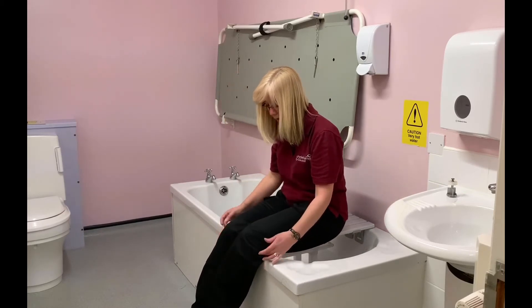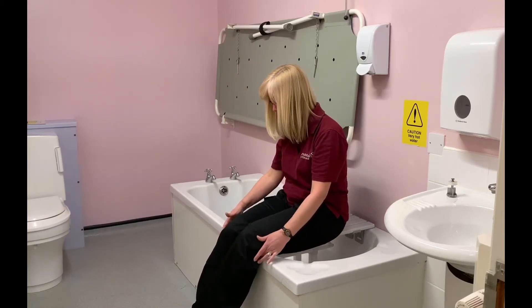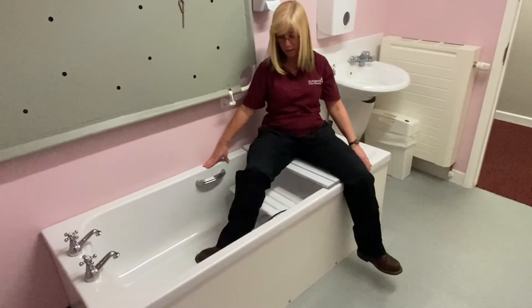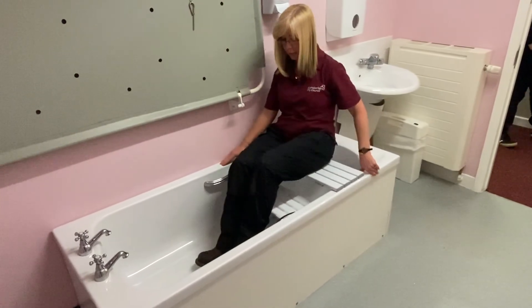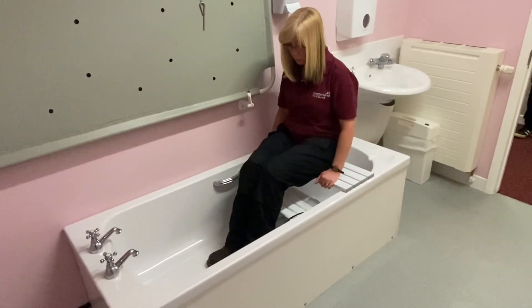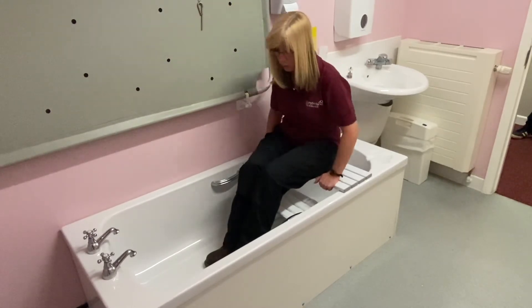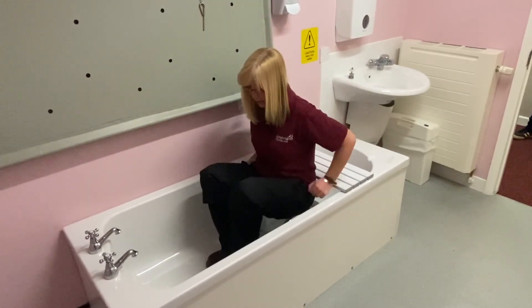The customer pushes themselves backwards until they can feel the bath at the back of their knees, then placing their hands on the side of the bath, they lift each individual leg over the bath. Once positioned in the middle of the bath board, the customer then lowers themselves down onto the bath seat.